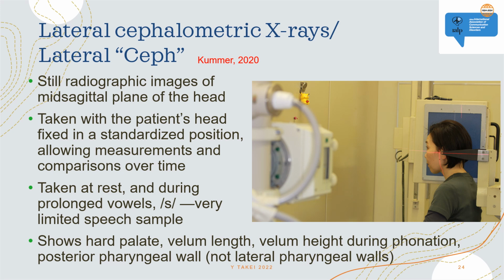Another way to visualize velopharyngeal closure is to use radiographic images. Video fluoroscopy is a popular technique, which Debbie will explain in the next section, but here I will explain a little bit about the lateral cephalometric X-rays, which are still used quite frequently in Japan. Lateral ceph is a still radiographic image of the mid-sagittal plane of the head, taken with the patient's head fixed in a standardized position. This allows measurement and comparison to be made over time.